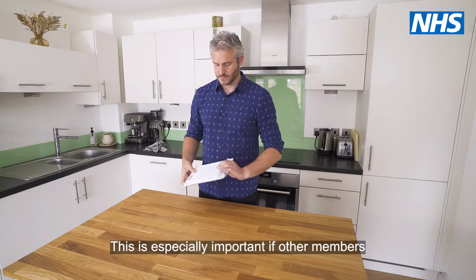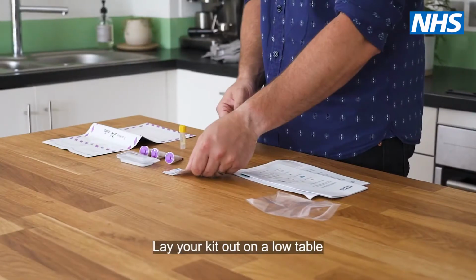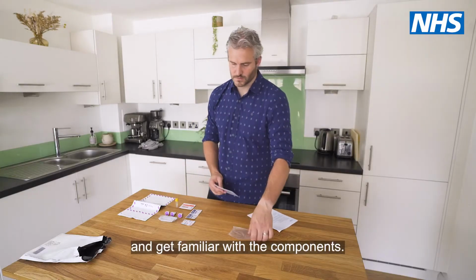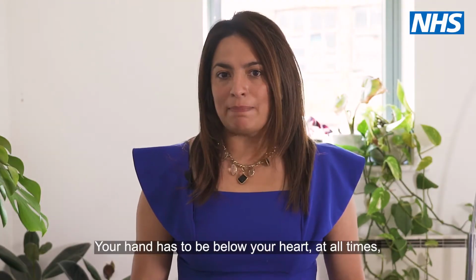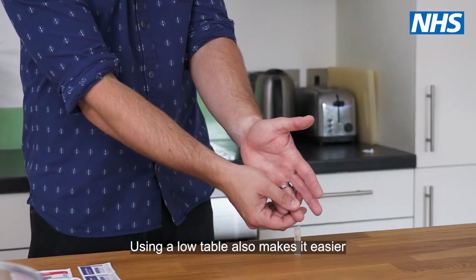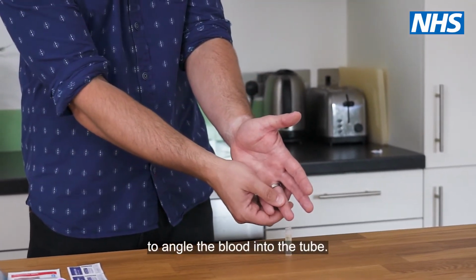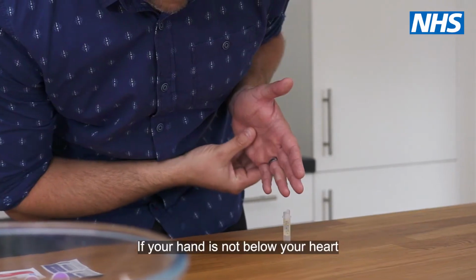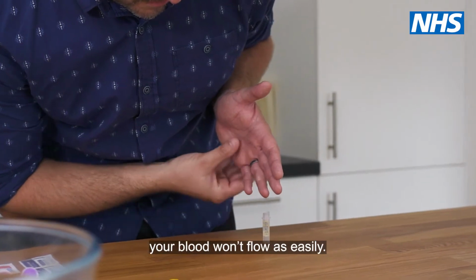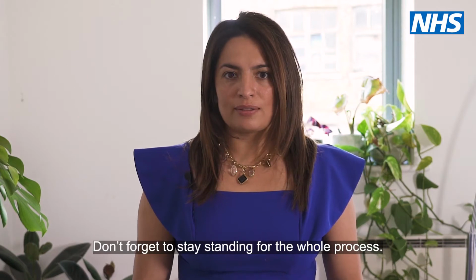This is especially important if other members of your household are also having the test done. Lay your kit out on a low table and get familiar with the components. Your hand has to be below your heart at all times to maintain the blood flow. Using a low table also makes it easier to angle the blood into the tube. If your hand is not below your heart and your arm is not outstretched, your blood won't flow as easily. Don't forget to stay standing for the whole process.